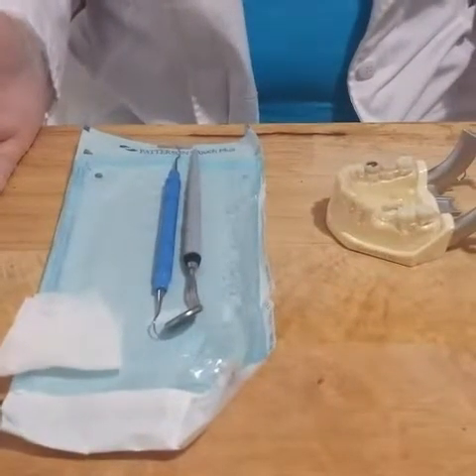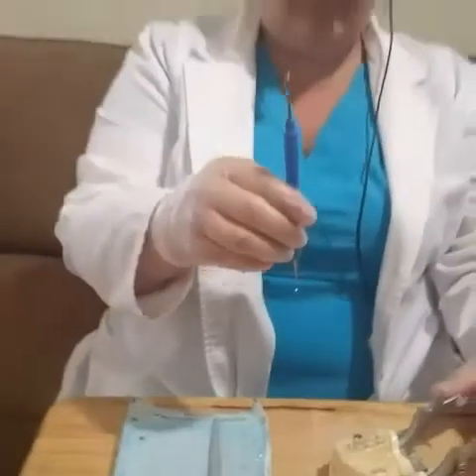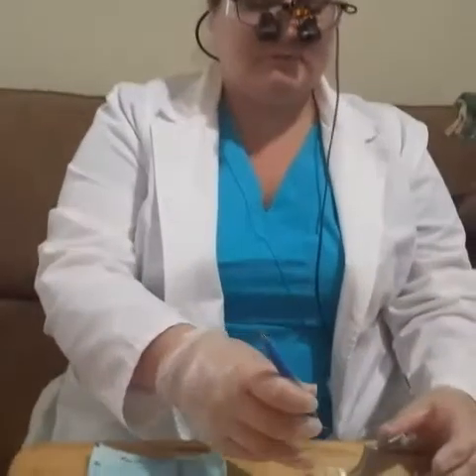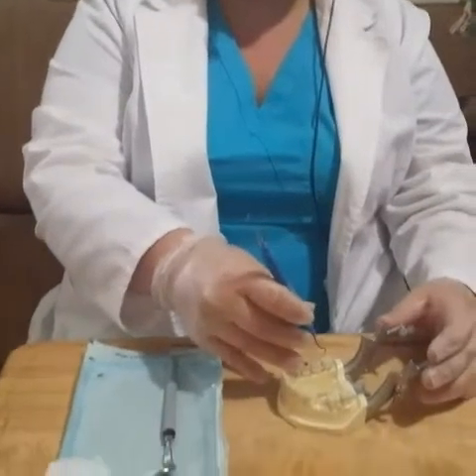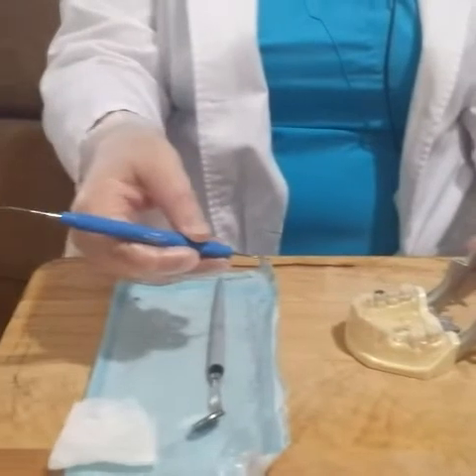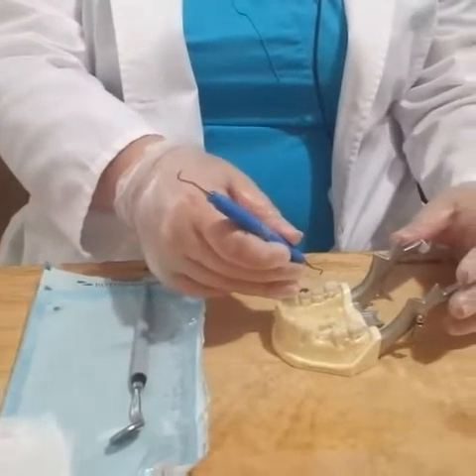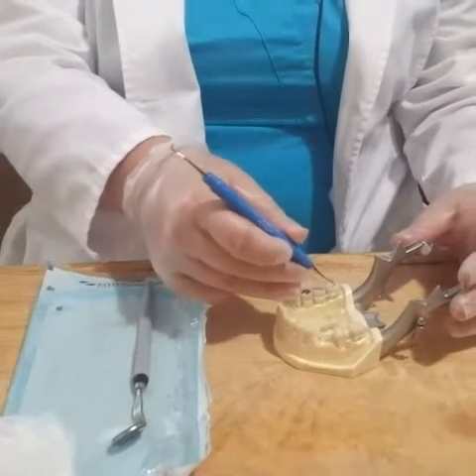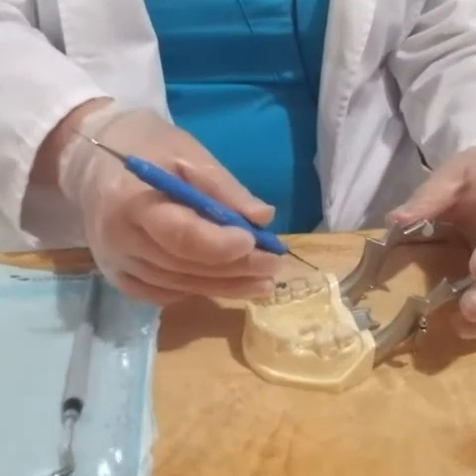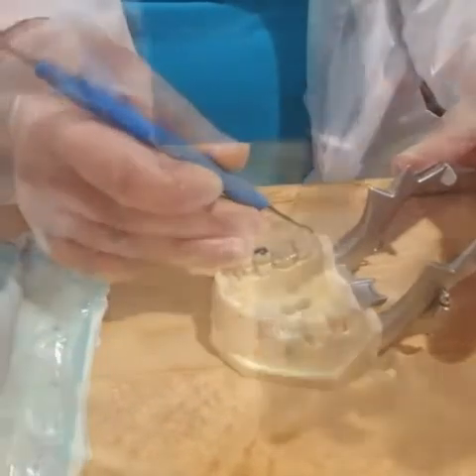Position yourself and patient for working in quad 4 buccal surfaces. Determine the correct working end for quad 4 buccal surfaces. Properly grasp the universal curet. Establish a stable fulcrum for instrumenting tooth number 32 buccal surface. Identify the distal line angle of tooth number 32.